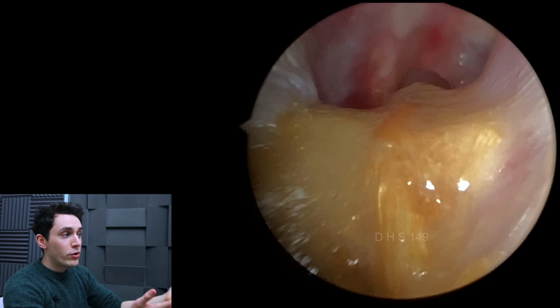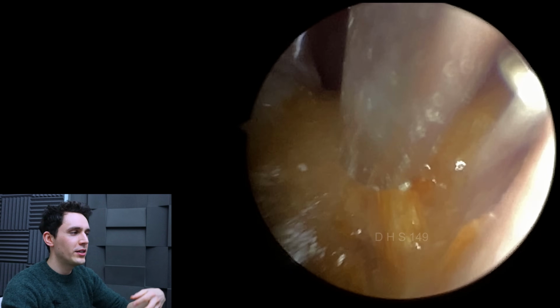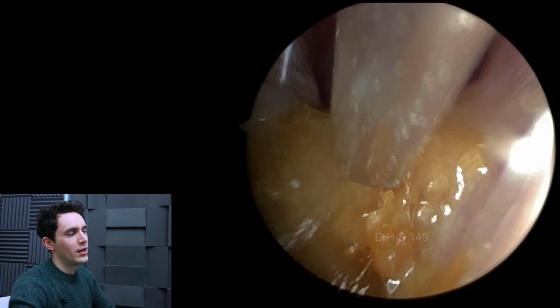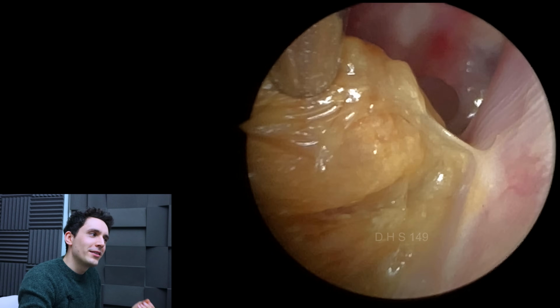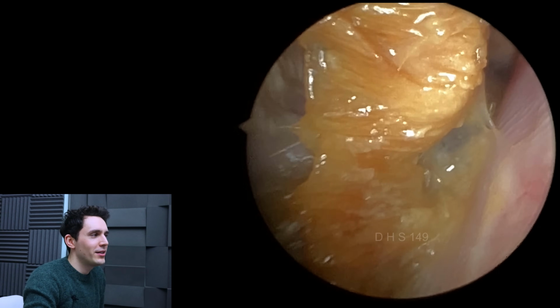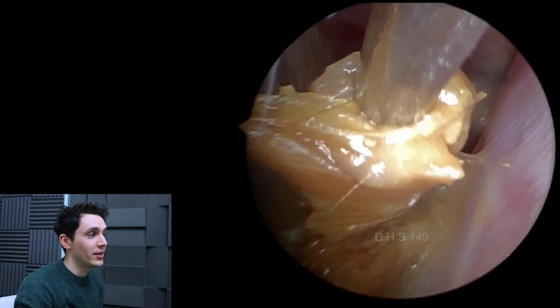There's actually quite a lot of mucosal discharge that's spilt through the perf, and that's why you'll see as we move through the video that all this discharge and liquid has almost a snotty quality to it, like a mucousy quality. And again, that's common with suppurative otitis media.